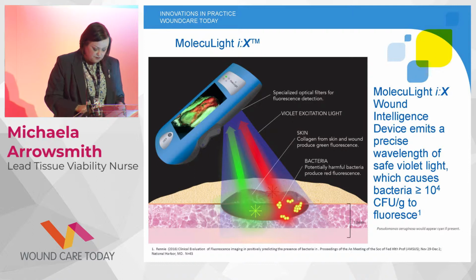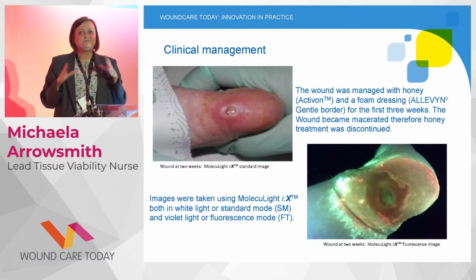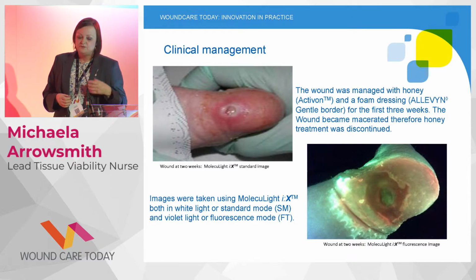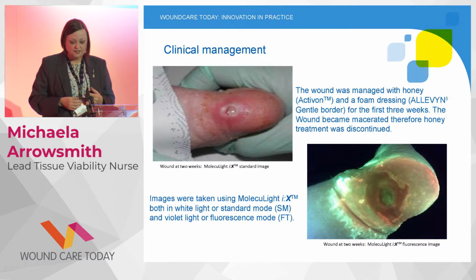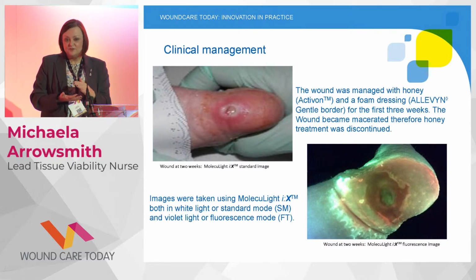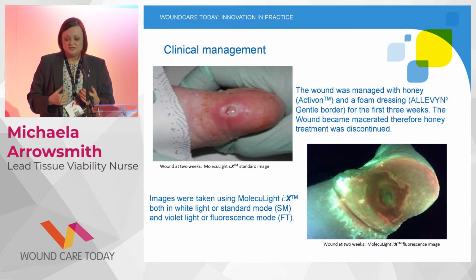So I used the Moleculight a second time because I didn't have time the first time. We applied the Moleculight to it, and you can see there the boots are still in place, so the pressure is still in place. We can't remove it at the moment because his treatment would be compromised.